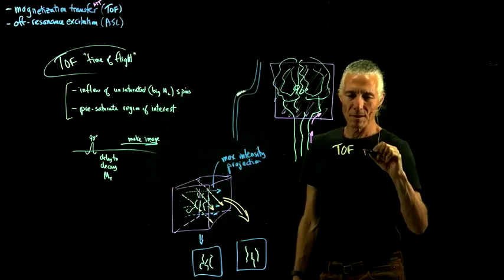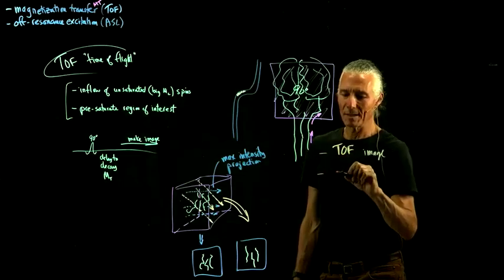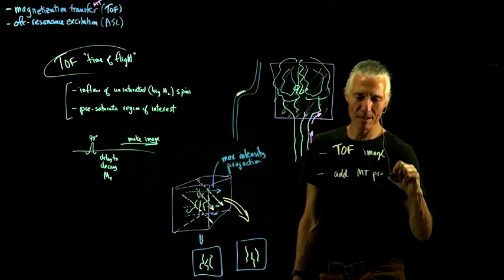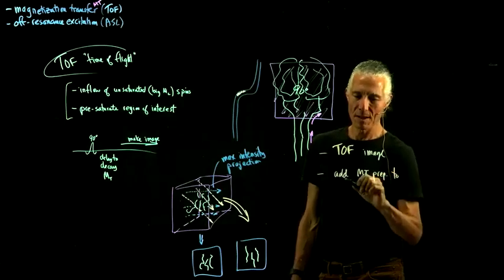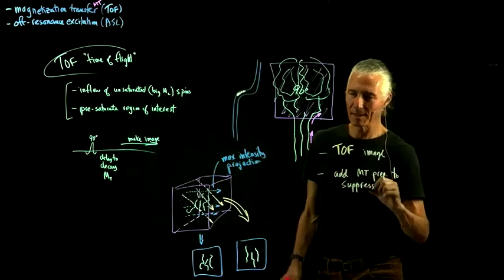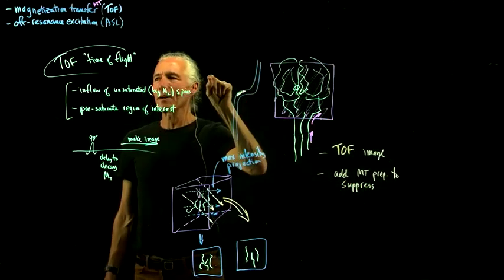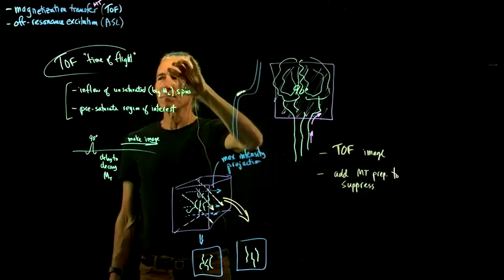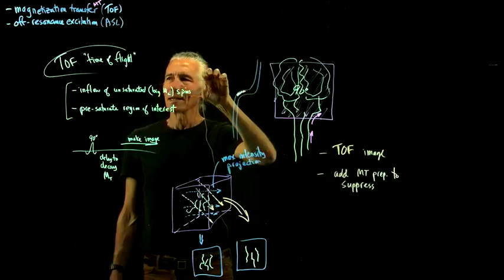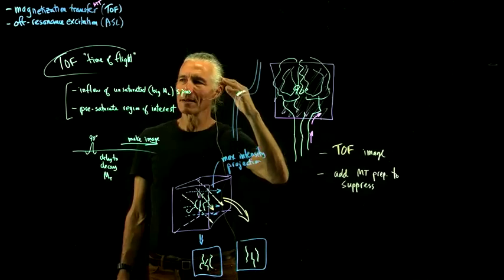So you do that image, but then to increase the contrast, also add a magnetization transfer preparation to suppress, because remember, the idea was the voxels where there was some transfer from these proteins, from these excited transverse magnetization of proteins, it ends up leaking over to the water signal, which is our main signal, and lowering it and suppressing it.